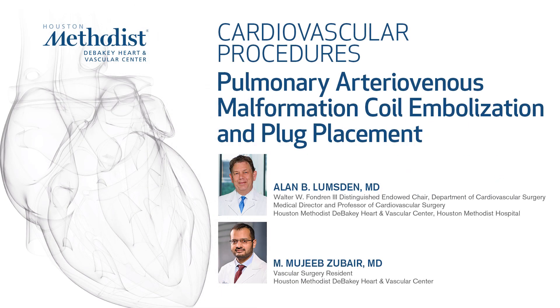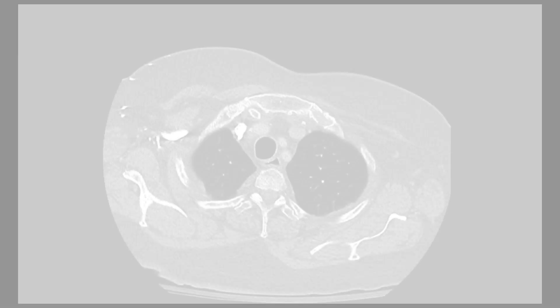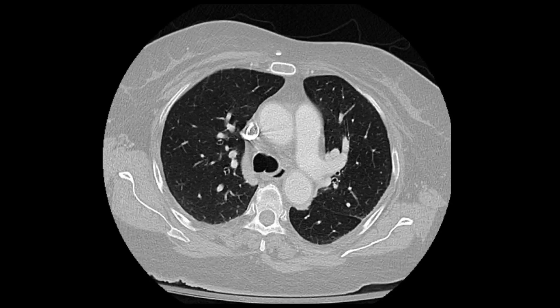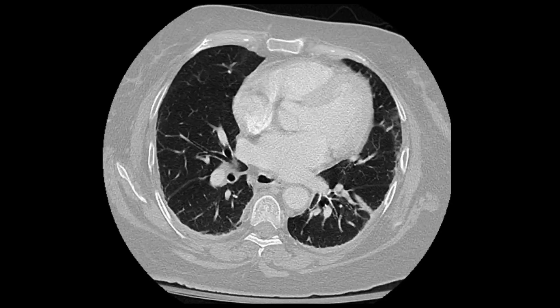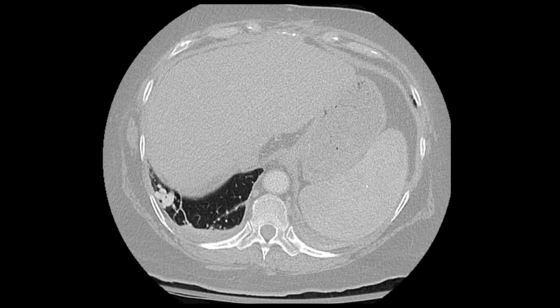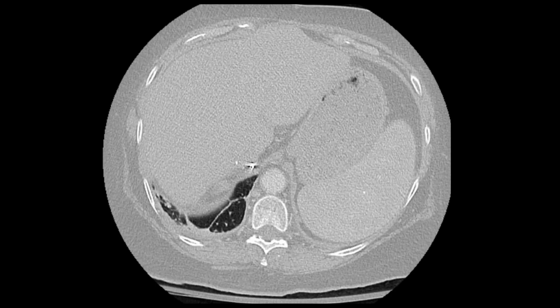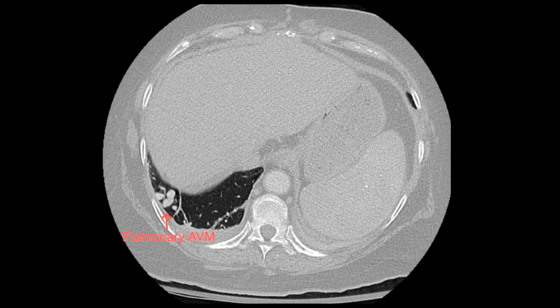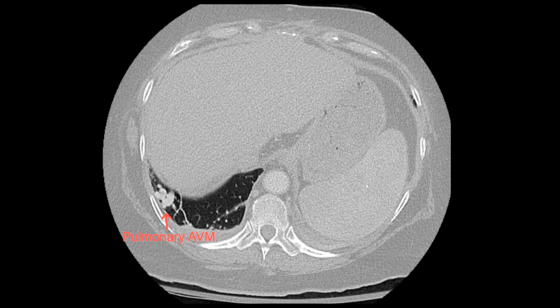This video demonstrates embolization and implant plug placement for a right lung lower lobe arteriovenous malformation in a 64-year-old female who presented with complaints of shortness of breath. She also has a history of liver and kidney transplant. CT scan of the chest demonstrated a 1.8 centimeter right lung lower lobe pulmonary AVM. We decided to treat this endovascularly.